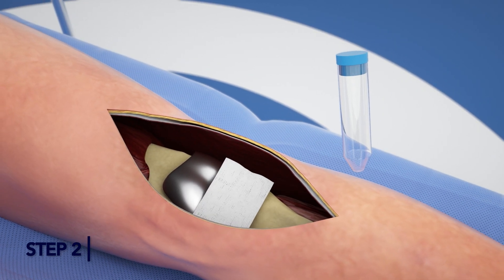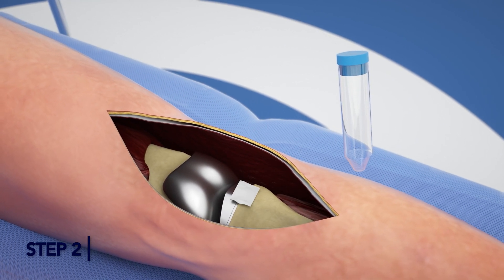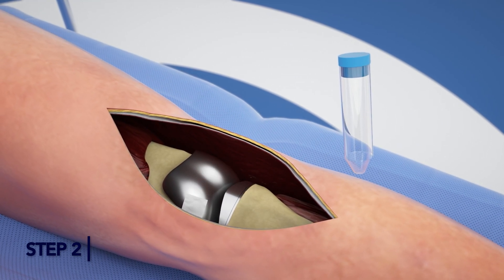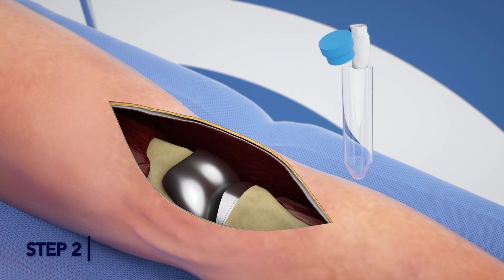Step 2: Obtaining Samples with Sterile Gauze. If there is frank pus in the area, it is best to remove the pus and wipe the tissue underneath it for the best results. To maximize the surface area sample, use the first sterile gauze pad to wipe the surface of the implants. Place the used pad inside the second empty 50ml vial.